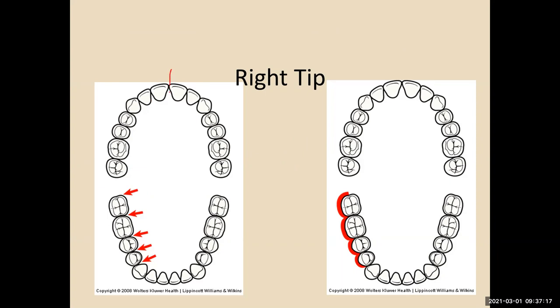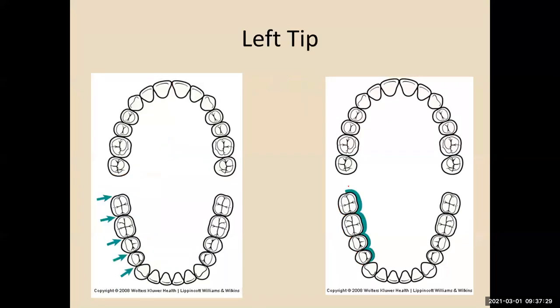You are usually going to be using only one quadrant, all right? So you'll be using one side for the lingual, switching it, and then using the other insert. So if you're doing the lingual, can you also do the interproximal of the facial? Yes. Yeah, with the way it's curved, it's great.